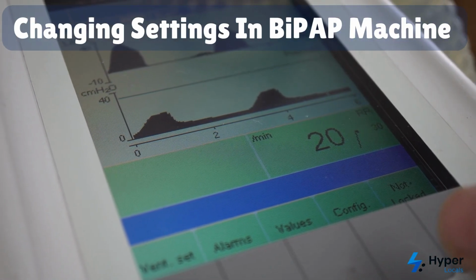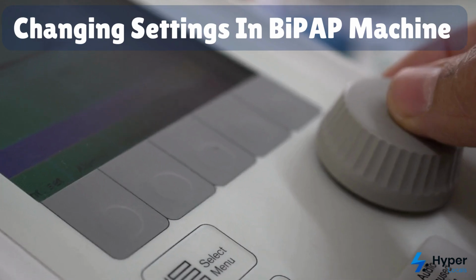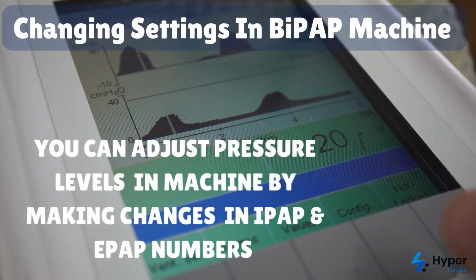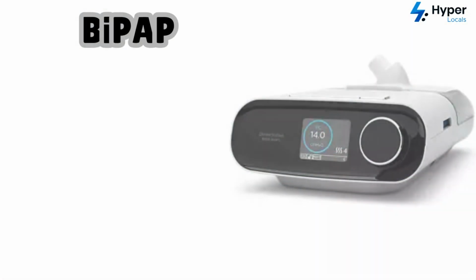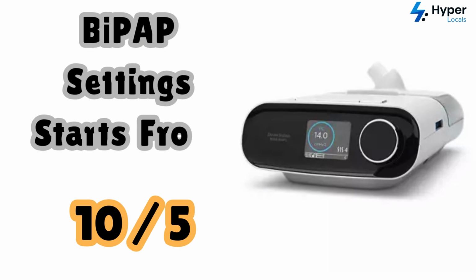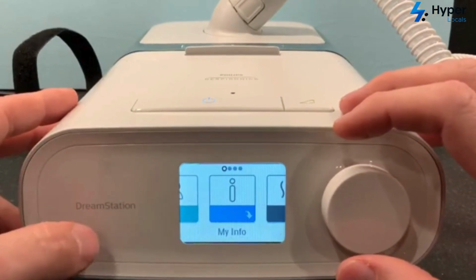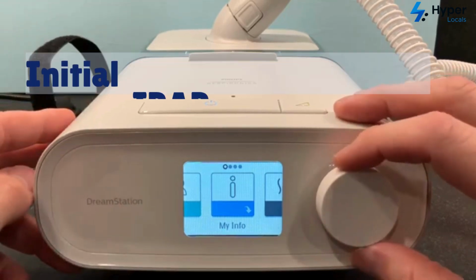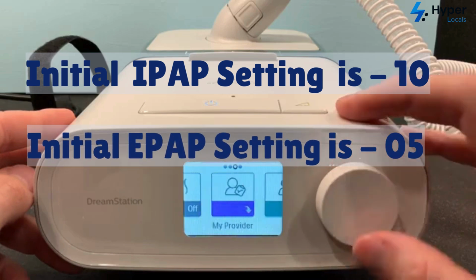Switching gears just a bit, let's talk about making changes to BiPAP settings. Depending on the patient's needs, you can make adjustments to the IPAP and EPAP pressure levels in the settings of the machine. Now a good starting point for BiPAP is 10/5. Now of course, this is just a general example. This is not always the case, and what I mean by this is that the initial IPAP setting would be 10 and the initial EPAP setting would be 5.